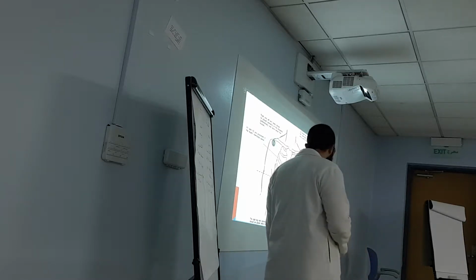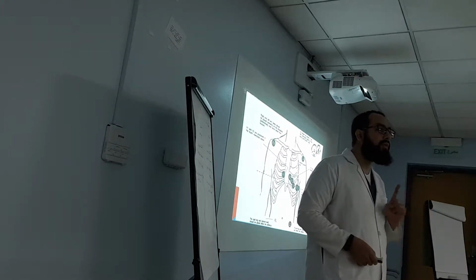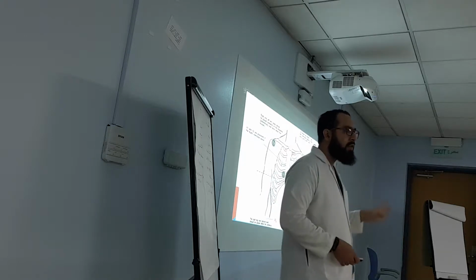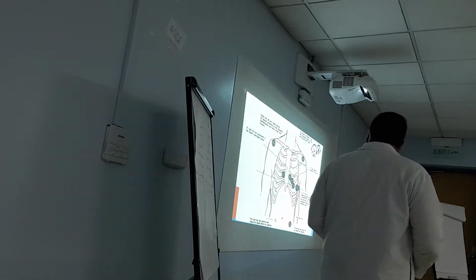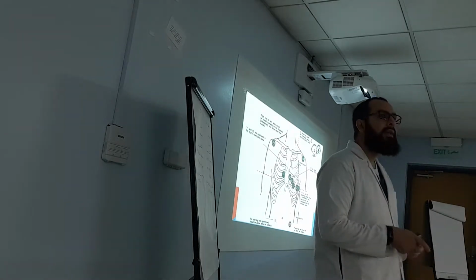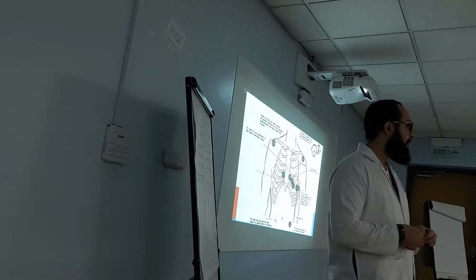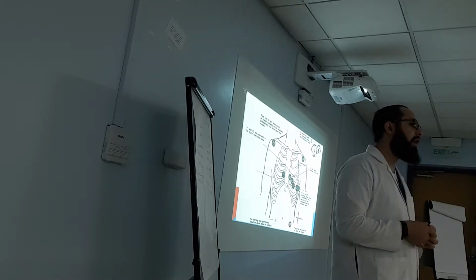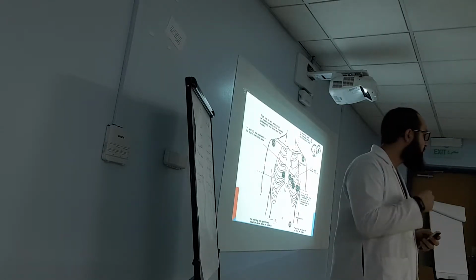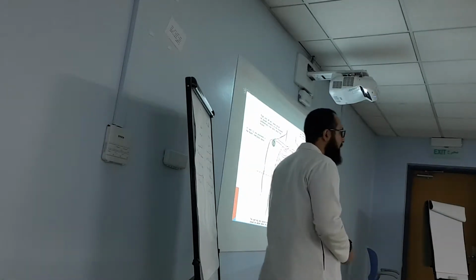But the right leg does not produce part of the ECG, but is very important for making your ECG without artifact. The right leg lead is the ground lead. Electricity normally has artifacts, so to discharge this artifact and have the pure ECG, we place the right leg lead.